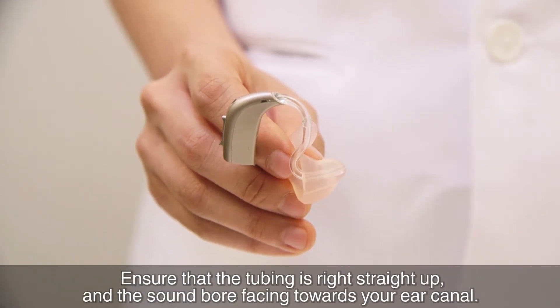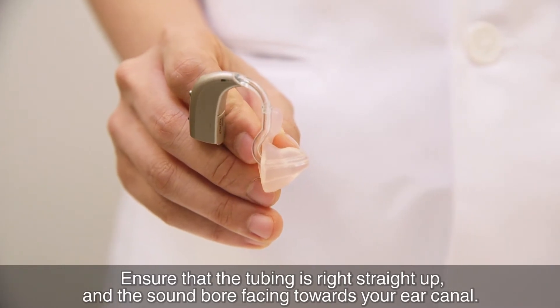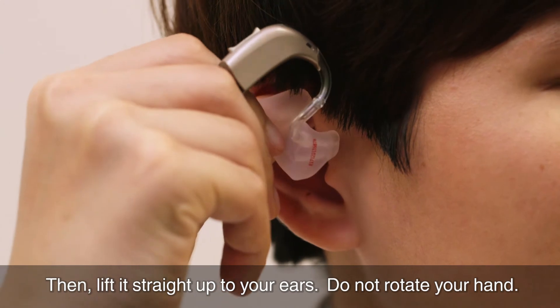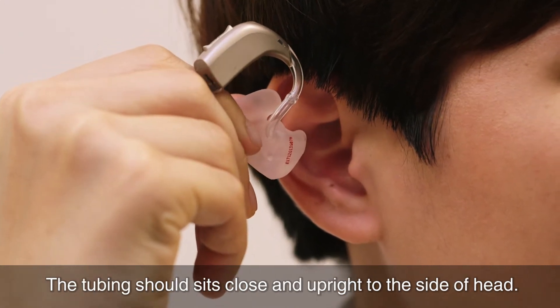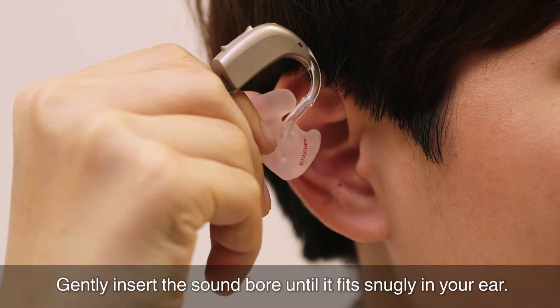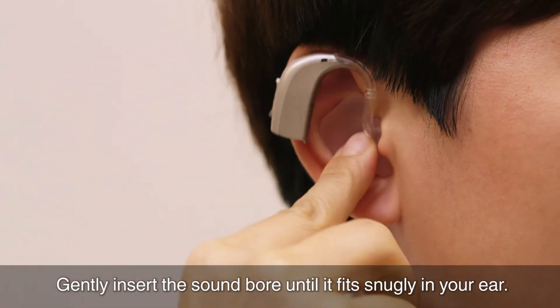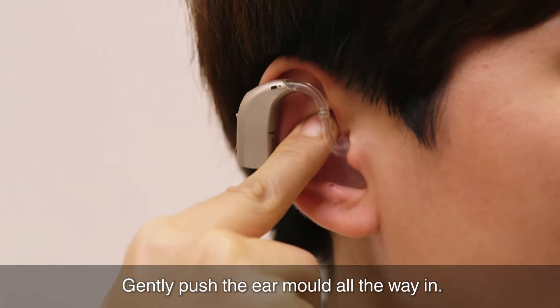Ensure that the tubing is straight up and the sound dome facing towards your ear canal. Then, lift it straight up to your ears. Do not rotate your hand. The tubing should sit close and upright to the side of the head. The sound dome should be directed towards the ear. Gently insert the sound dome until it fits snugly in your ear. Gently push the ear mould all the way in.